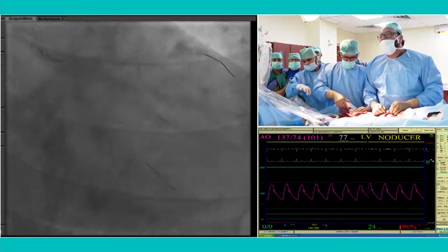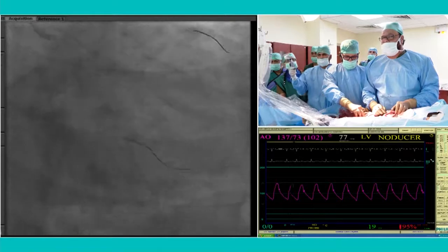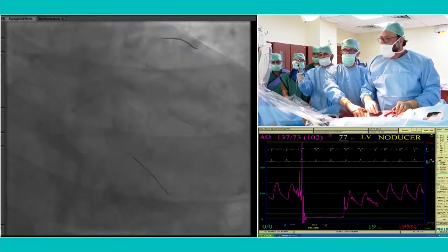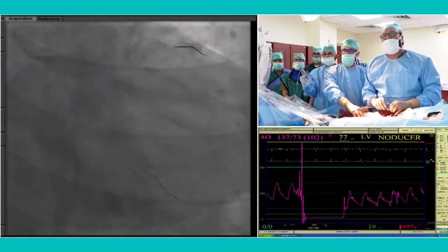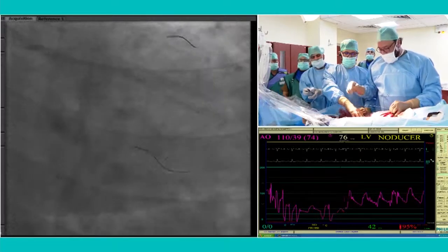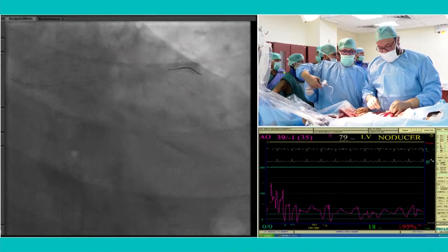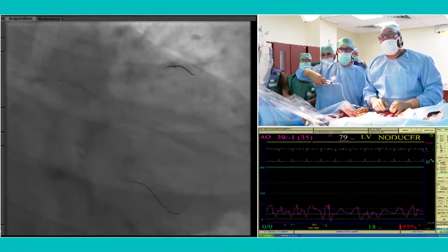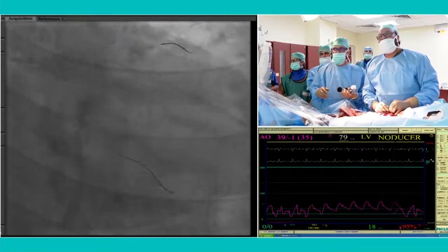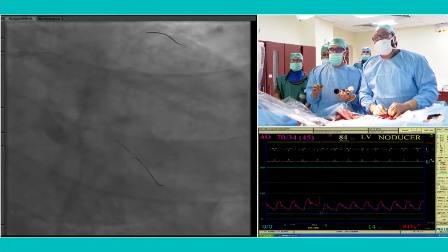Then after putting a wire through the stent strut, you'll have a lot of difficulties. No, we had done the IVUS. There was no significant calcium at the circumflex ostium. If there is not much of a disease, I would rather not pre-dilate and do everything after I have finally wired. So if you had calcium in the ostial part of the circumflex, you would have done a preparation of the lesion, right? Oh yes, definitely.